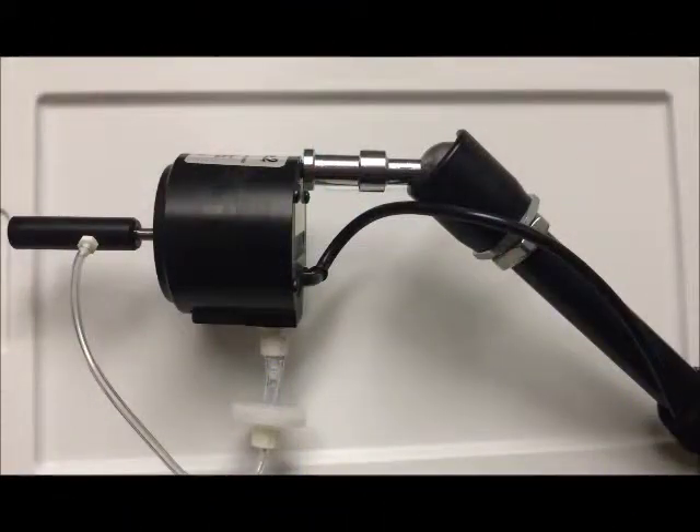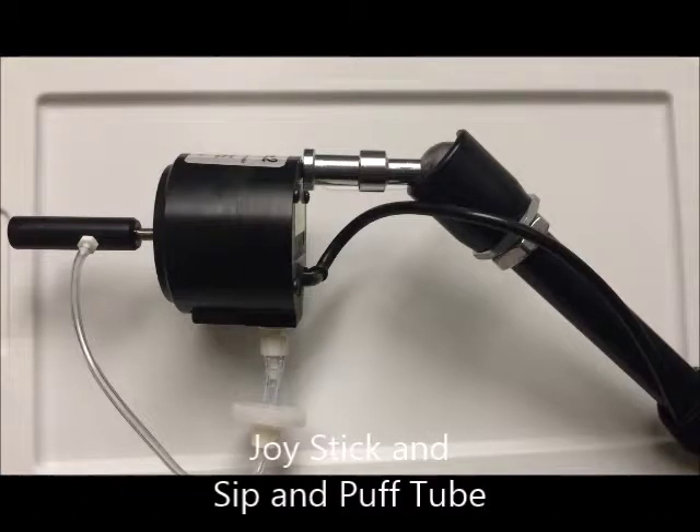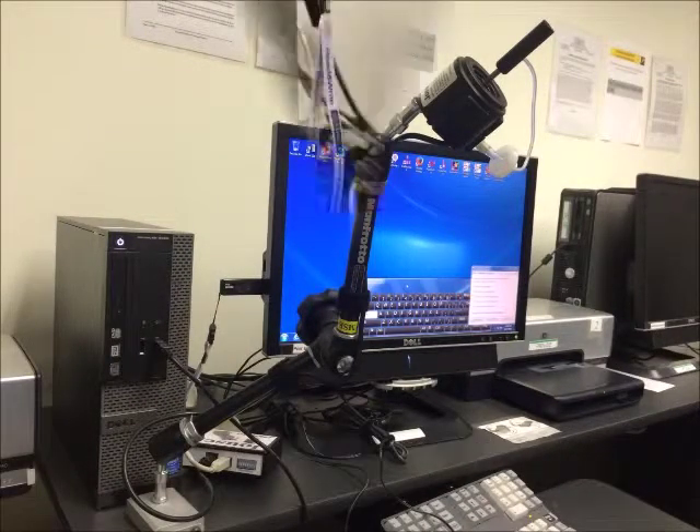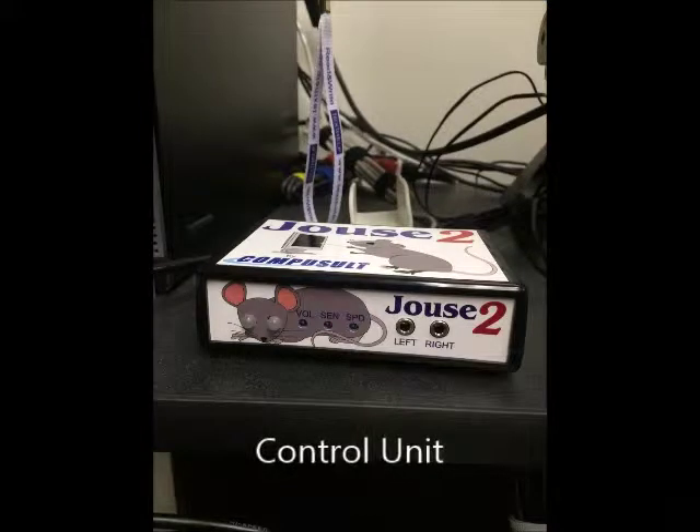In this video, we will be referring to and demonstrating with a Jouse 2 Sip and Puff attached to a computer. The parts of this include a joystick and sip and puff tube, a mounting arm with a clamp, and the control unit with USB cable to attach it to the computer.